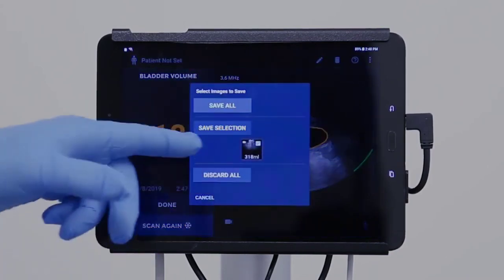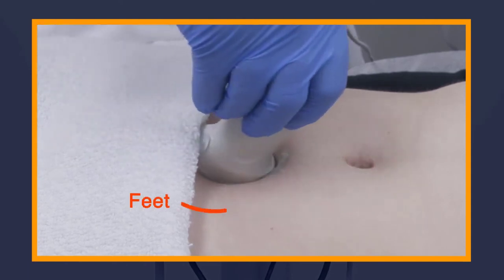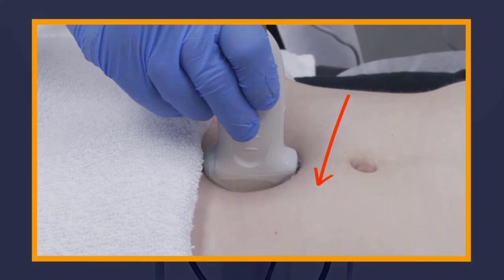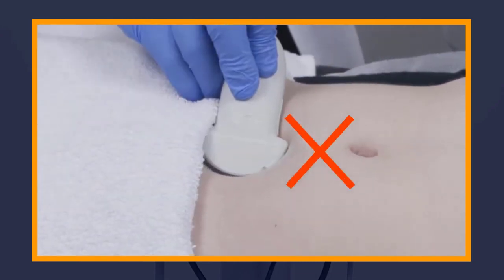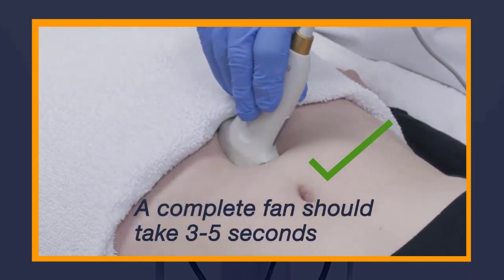If the bladder is not found right away, the system may prompt you to reangle the probe towards the patient's head or down towards the patient's feet. It may also prompt you to apply firmer pressure or more gel. Do not fan too fast or too slow — maintain consistent pace and pressure during the scan. As a guideline, a complete fan should take around three to five seconds.